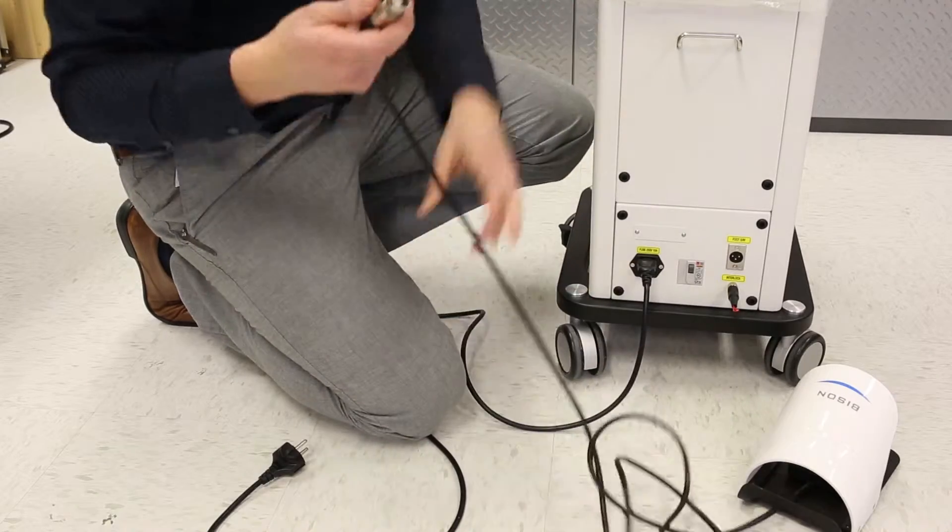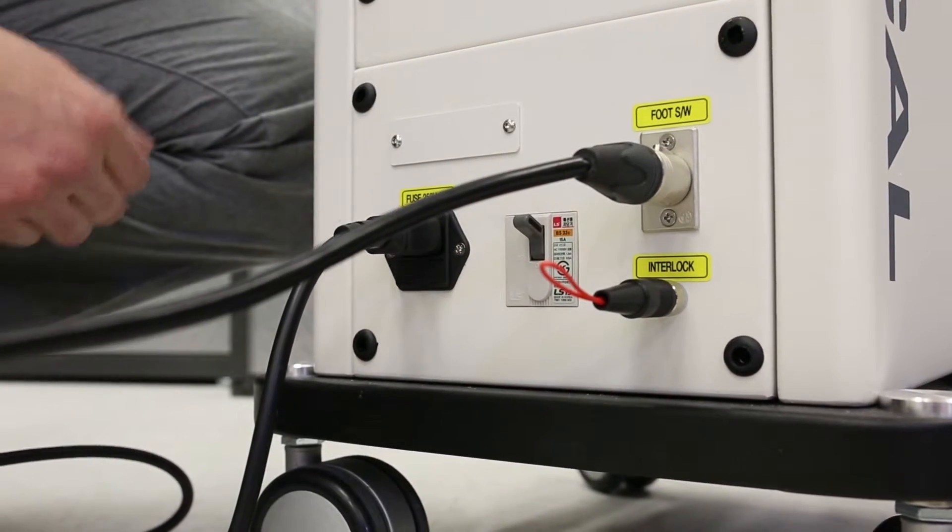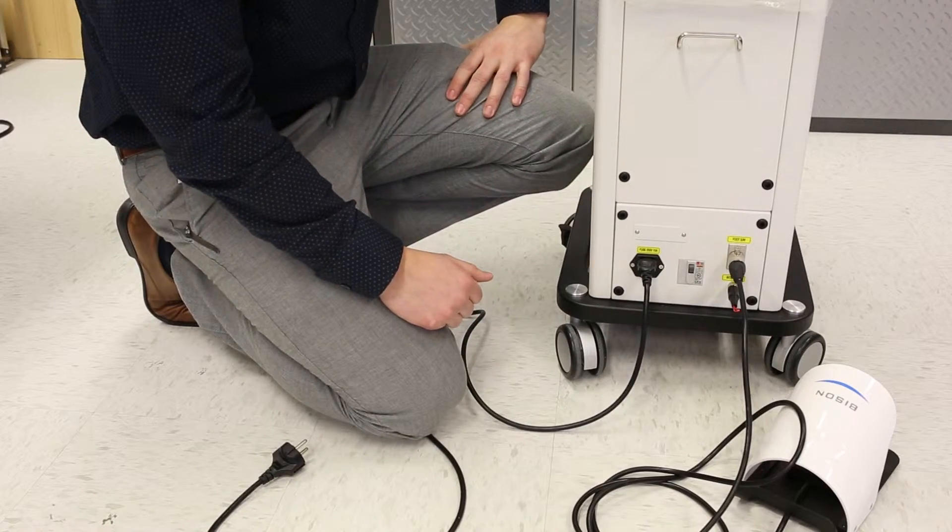Then the next thing is the foot pedal. It's all labeled — that one's pretty easy. Just click that in and you're ready to go.